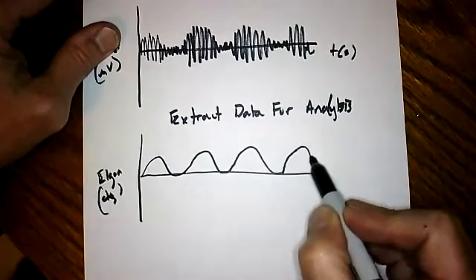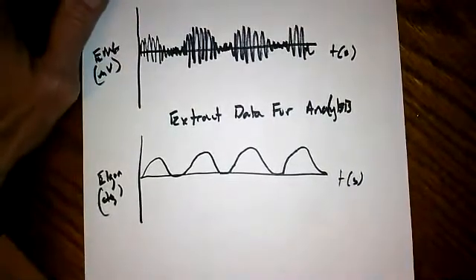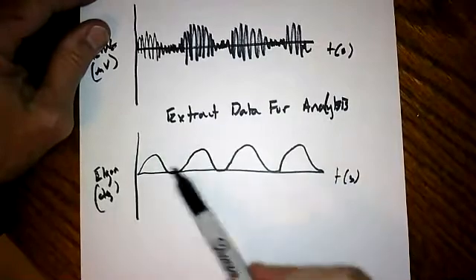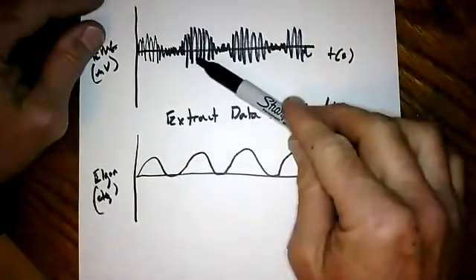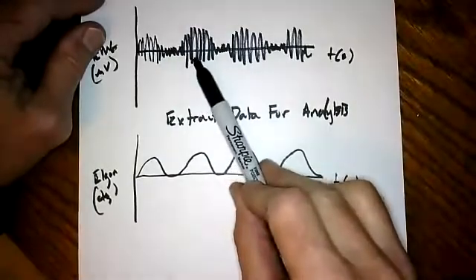And maybe this is, I'll tell you a little bit more about the activity. Maybe this is flexion and extension of the elbow. I don't know, something. But it's the Elgon set up on some joint, and we're seeing a repetitive pattern here. And now we can see that there's a link between whatever is happening here and what's happening up here.